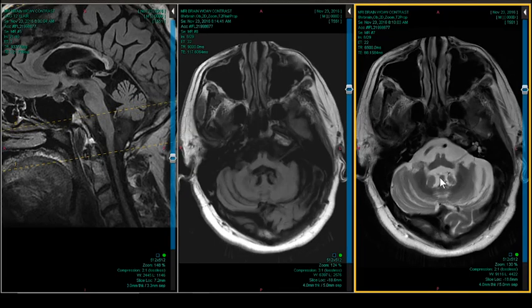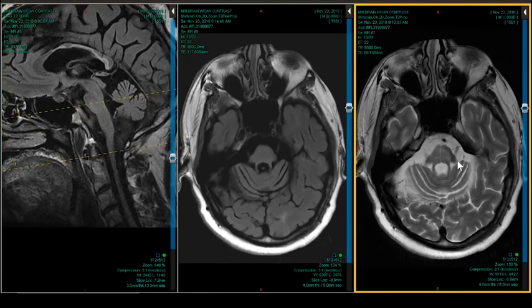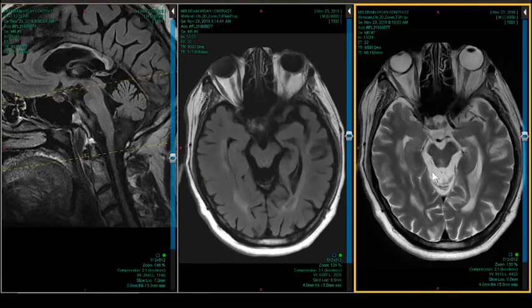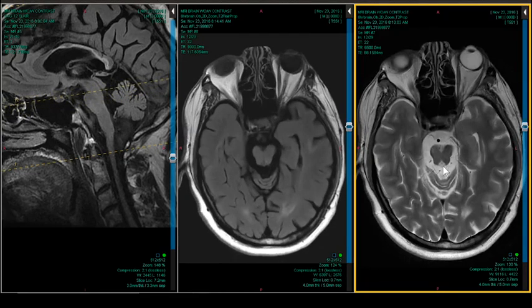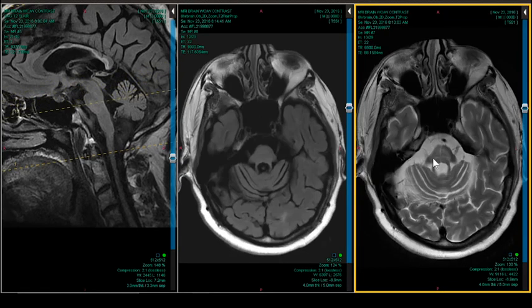Okay, let's just talk about peduncles for a second. The restiform body, the inferior cerebellar peduncle, that's atrophic. And look at the middle cerebellar peduncle, and that's where this hot cross bun sign comes from: atrophy of these fibers of the middle cerebellar peduncle. And this is your brachium conjunctivum, the superior cerebellar peduncle. So you've got to start looking at those structures and get yourself organized anatomically. You know, the aqueduct is big. I mean, this is a horrible disease.